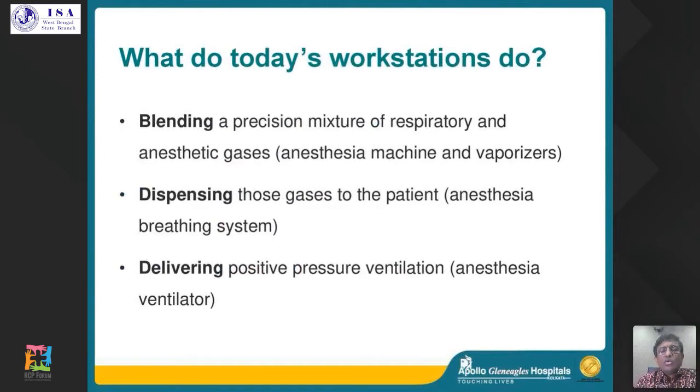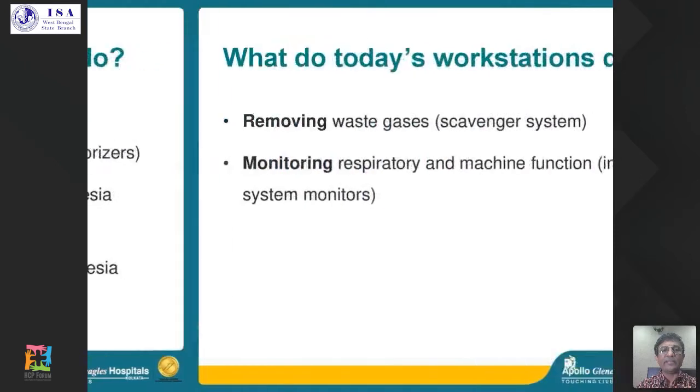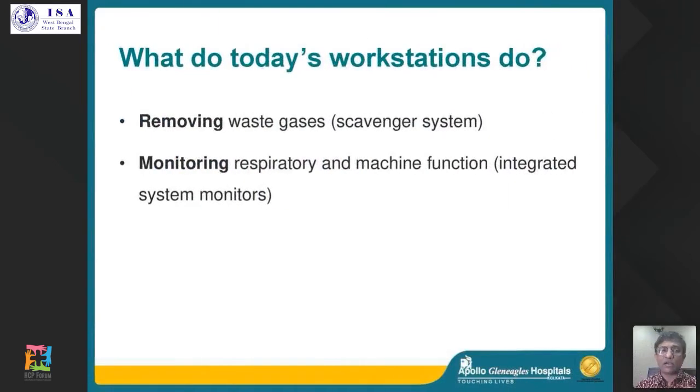What do today's workstations do? It blends a precision mixture of the respiratory and anesthetic gases, through the anesthesia machine and the vaporizers. It dispenses these gases to the patient through the breathing system, has the ability to deliver positive pressure ventilation through the ventilator, and it has also the innate ability to remove waste gases, the scavenger system, and it has also got the integrated system monitors for monitoring respiratory and the machine function.